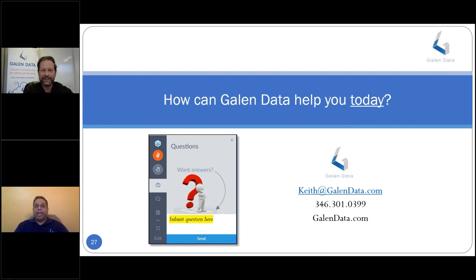Sure. So ultimately, I think there will be dashboard fatigue, right? If you have to log into 20 different systems, and each device is a new system that you need to log in to, there'll be dashboard fatigue. So ultimately, it's important to be able to interoperate with a healthcare record keeping system like an EHR, which most hospitals have. And EHRs have opened up more and more in the last 10 years or so, so that it's easier and easier to integrate. Still a lot of work, but it's easier than in previous times.